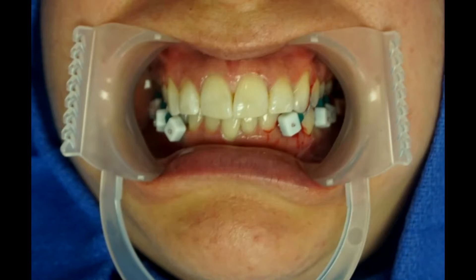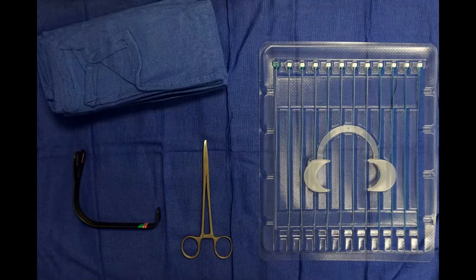When used as a set, these devices can establish maxillomandibular fixation in a minimally invasive fashion. A kit includes a series of ties and a cheek retractor. These can be applied using a simple needle driver and a Minnesota retractor.